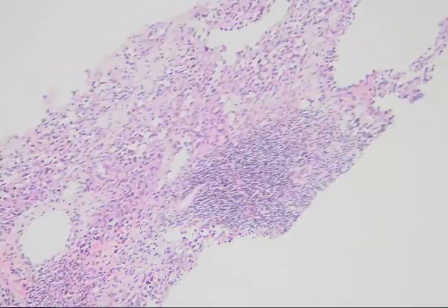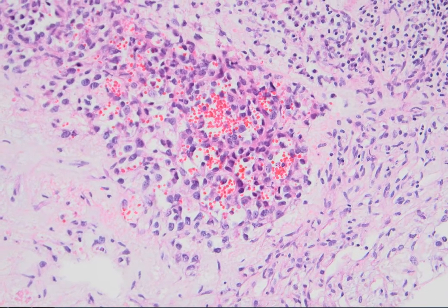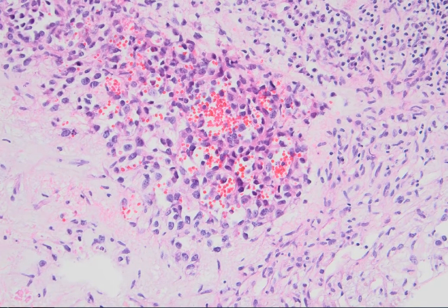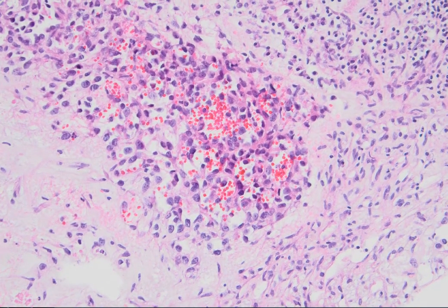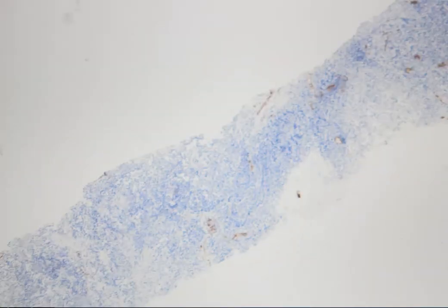Here is again a good example with the malformed vessels. The neoplastic cells try to produce vessels with blood in them, and then we ordered CD34, and CD34 is negative.